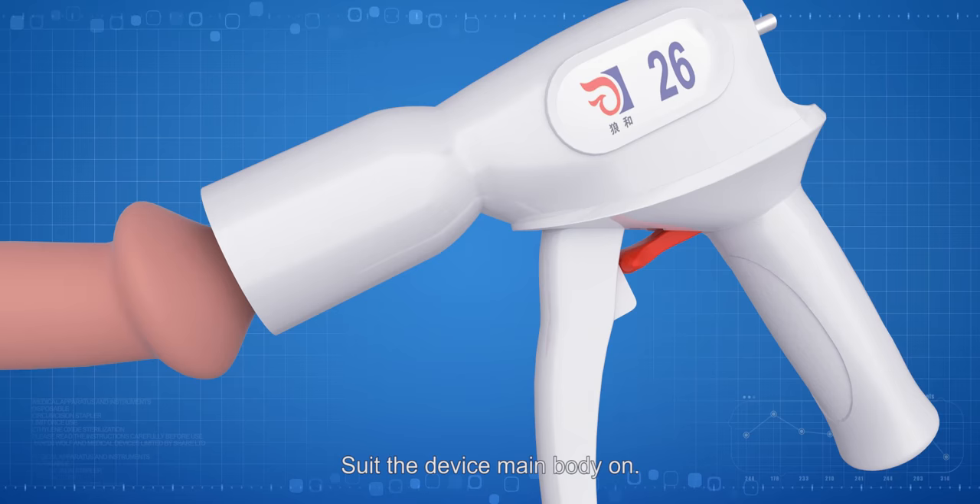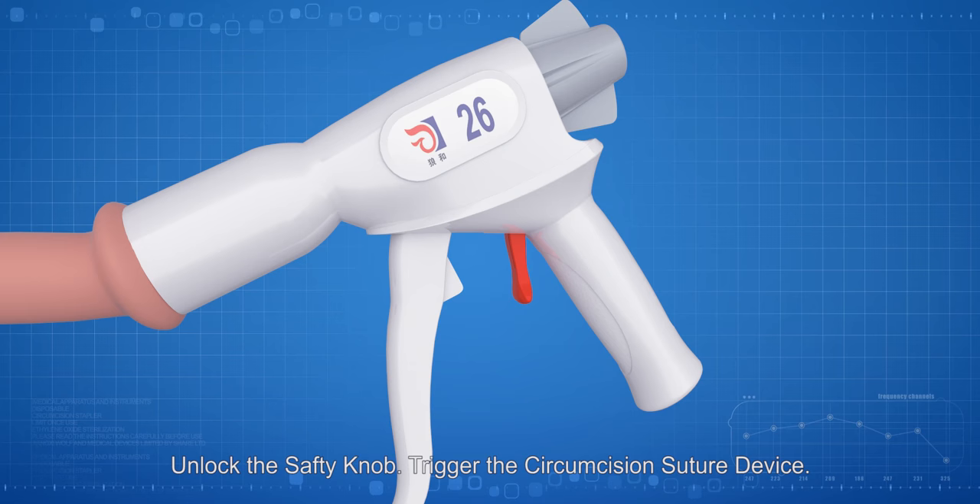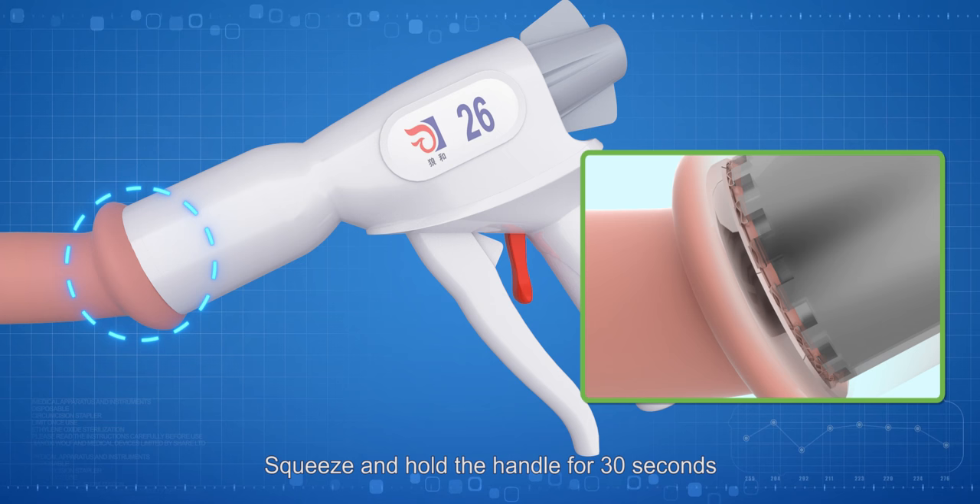Suit the device main body on clockwise, and tighten the adjusting knob. Unlock the safety knob. Trigger the circumcision suture device. Squeeze and hold the handle for 30 seconds.